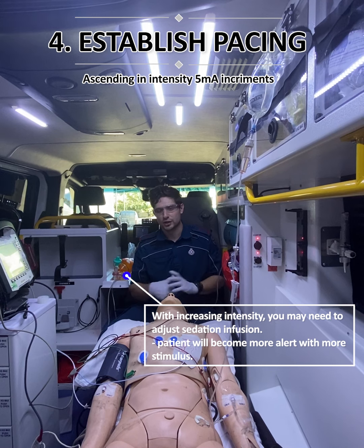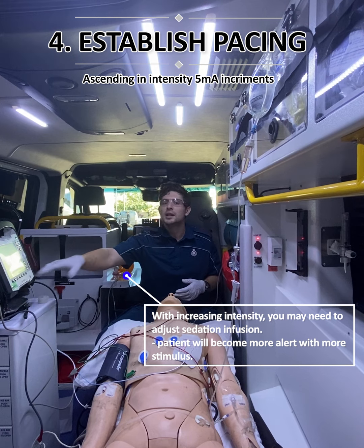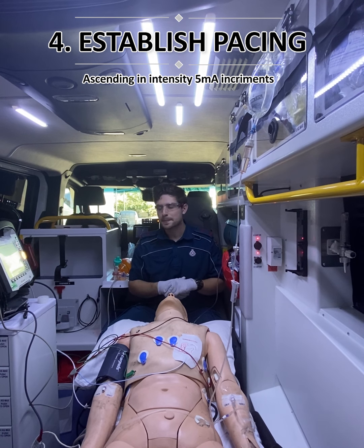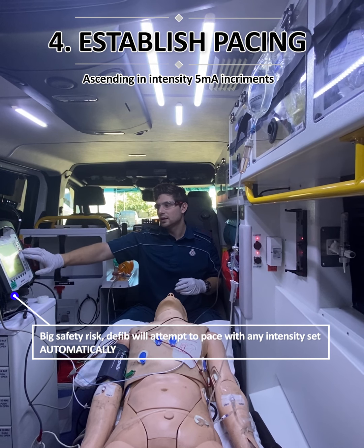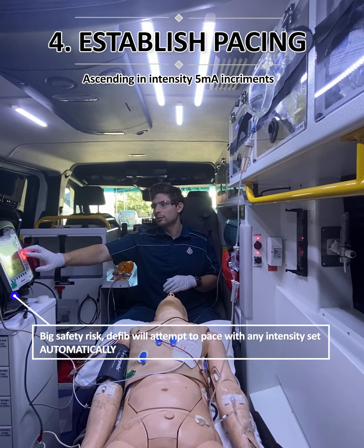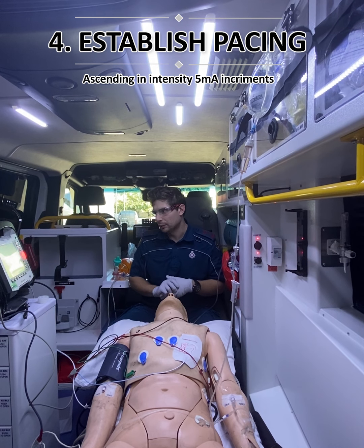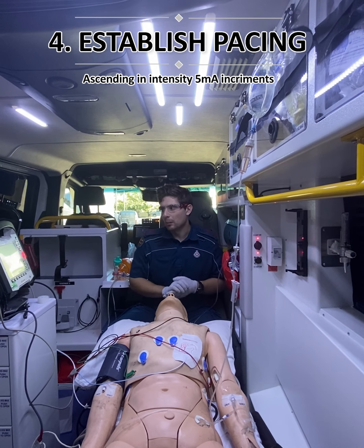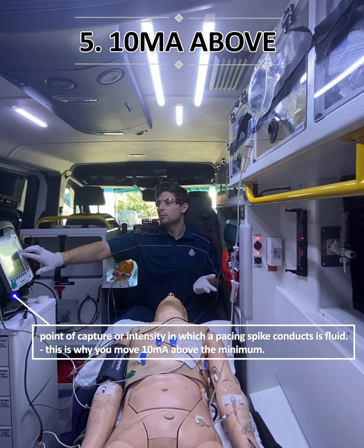If it was a GCS3 patient who had a ventricular standstill, for example, we'd probably work our way down from 150 milliamps and then get to the lowest point that we could, and then probably increase by 10. And again, we obviously know our measures of success. So the moment we increase this intensity to 10, it will automatically start pacing this patient. And as we go up and through, we may find it at an intensity of 50 that we're getting a pacing spike through the patient, generating, as we have pacing spikes here, a QRS and T-wave complex. At that point, we're going to move 10 above.